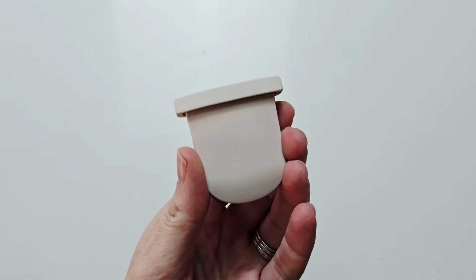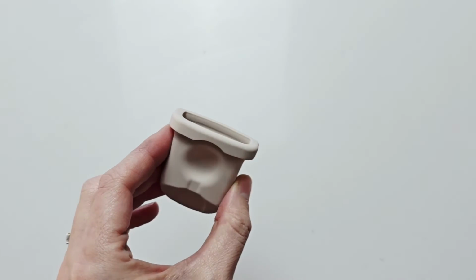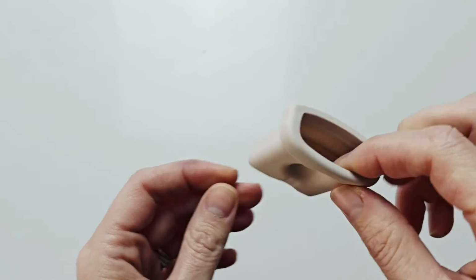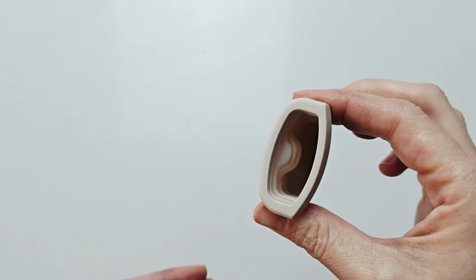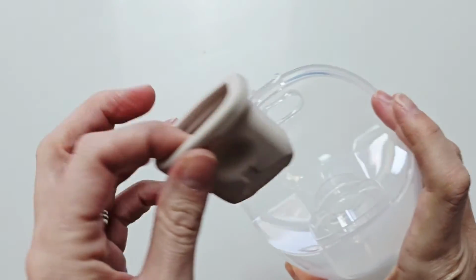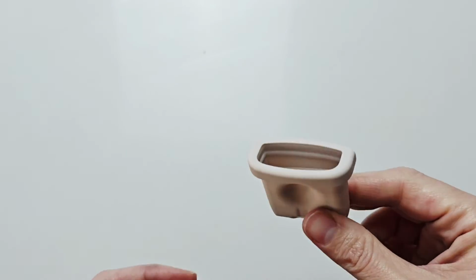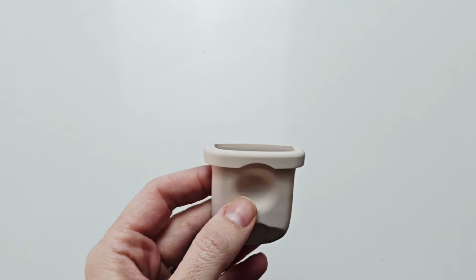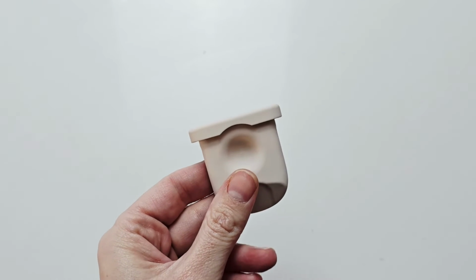Again, you have your diaphragm. Now these should last for around 2 to 3 months. But again, if you're finding that it's getting a bit loose within your pump, it sits in here, if you're finding that it gets a little bit loose, then you are going to want to be swapping these out around every 2 to 3 months, depending on how often you are pumping.